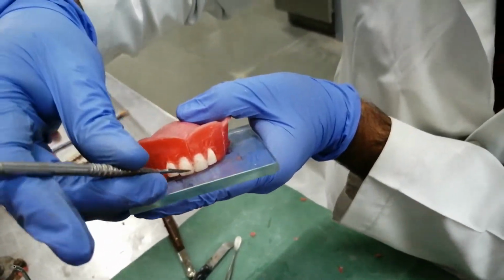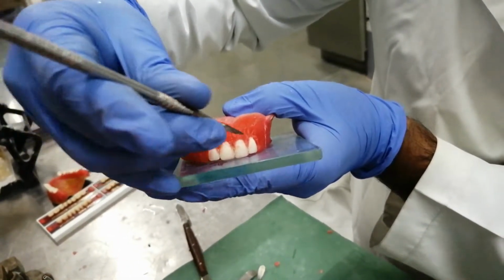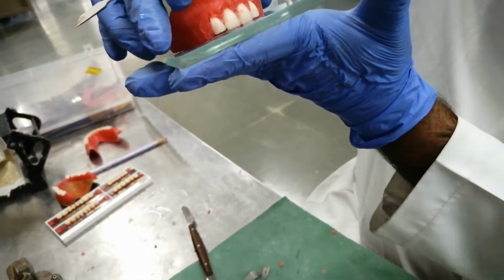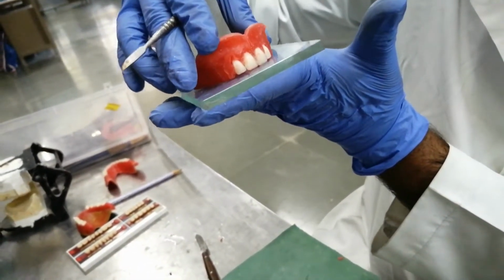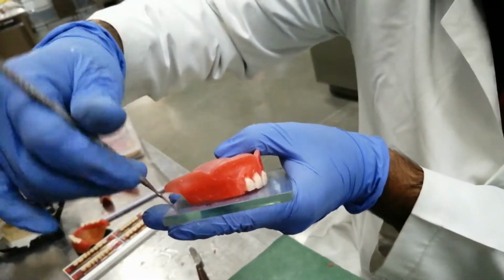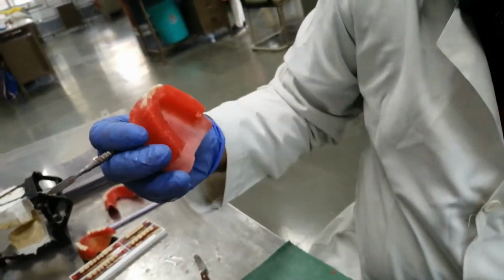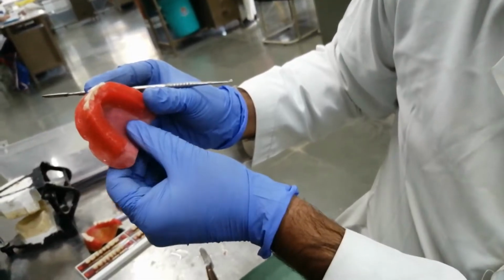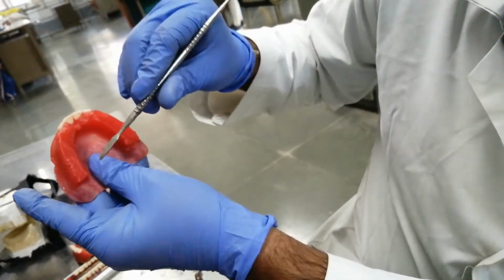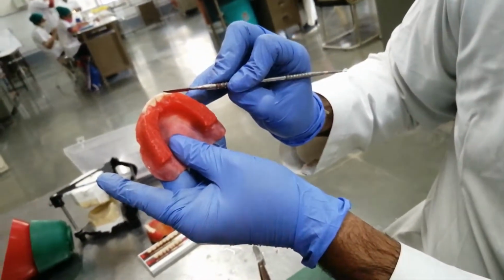Central incisors' incisal edges are touching the glass plate, and lateral incisors' incisal edges are 0.5 mm above. And rest of the occlusal rim should touch the glass slab as well. And also you have to check the arch form and the alignment of the teeth.